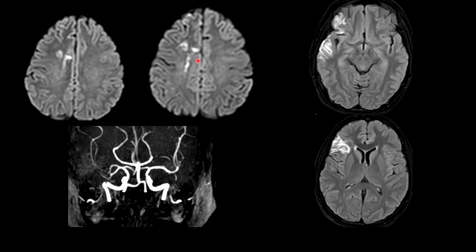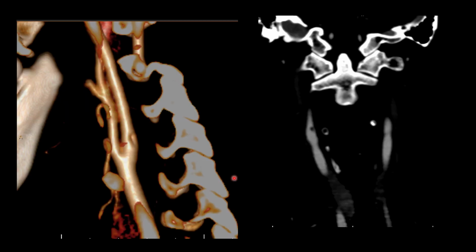So this is the MRI in this patient. Diffusion weighted images show areas of acute infarcts in the centrum semiovale and the right frontal lobe. FLAIR shows prior infarcts in the right frontal lobe and right temporal lobe. On MR angio, we are able to see areas of narrowing in the right middle cerebral artery, with attenuated signal intensity of the M1 and M2 segments.